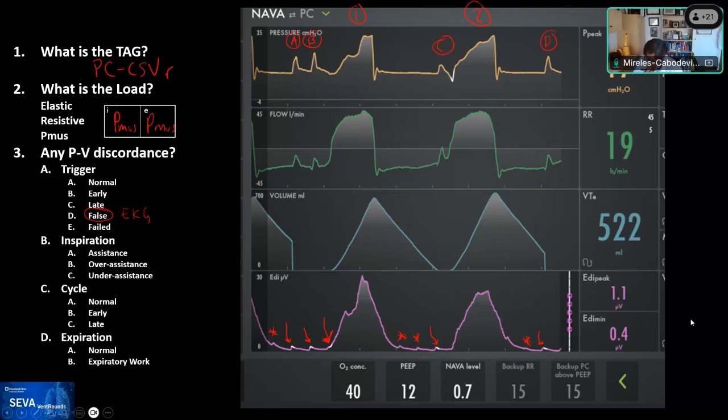Rob, comments? I think that's a very good example. It seems to me pretty rare. It doesn't happen very often because the filtering is usually pretty good. Yeah, but when it happens, now you know.